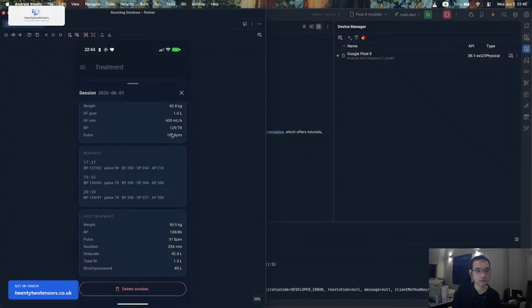Because dialysis is taking the blood from the body, moving it outside and filtering it through a filter. The filter will stop the waste and the water from the blood, which cleans the body.